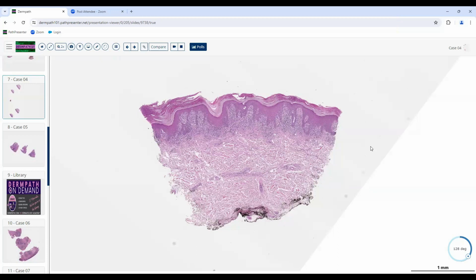Also, I was thinking of things like lichenoid things on acral skin. So maybe also lichen striatus, but again, you didn't see it deeper. Very good idea. With lichen striatus, you should see some inflammation around the adnexal structures, like the sweat glands deep, so that's a possibility.